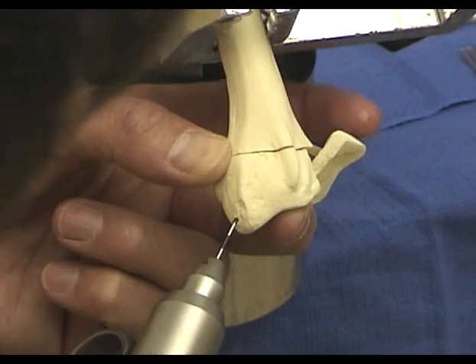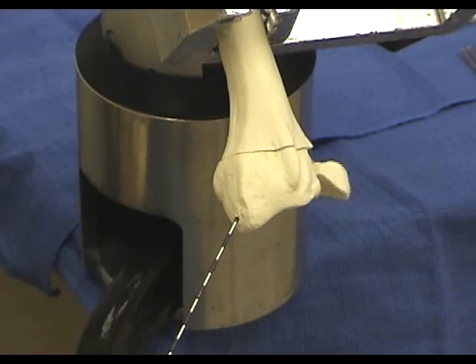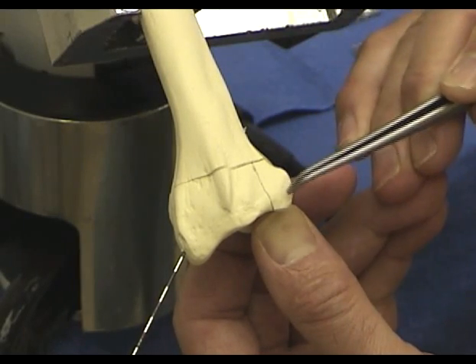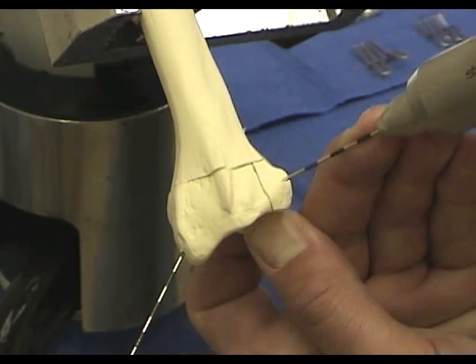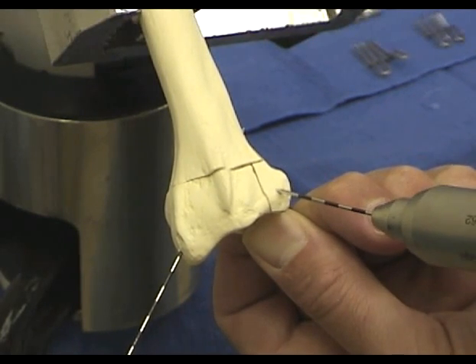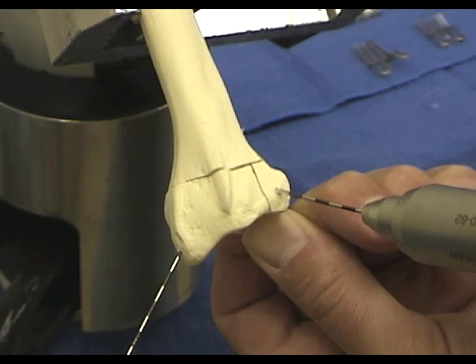The pin should not exit dorsally or it will interfere with the ulnar pin plate. The entry site for the ulnar corner is over the flat dorsal surface, not the distal rim. The pin is initially directed perpendicular to the bone surface, then angled proximally and slightly radially as it is inserted.